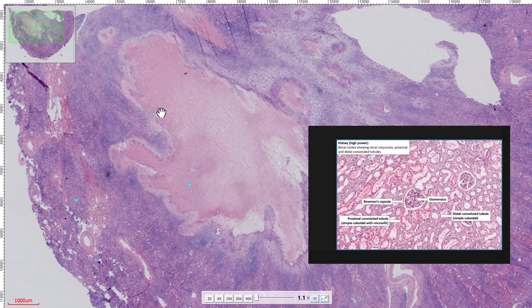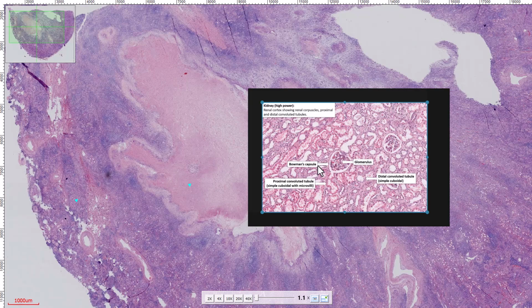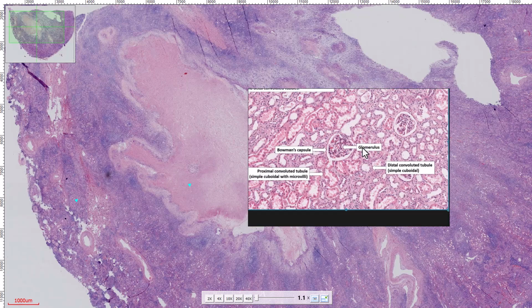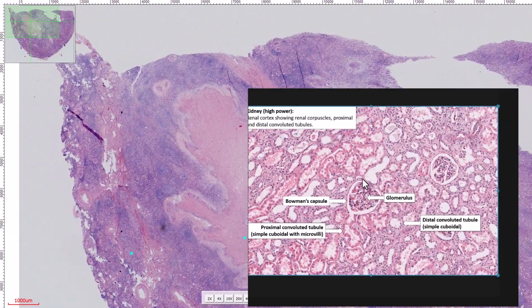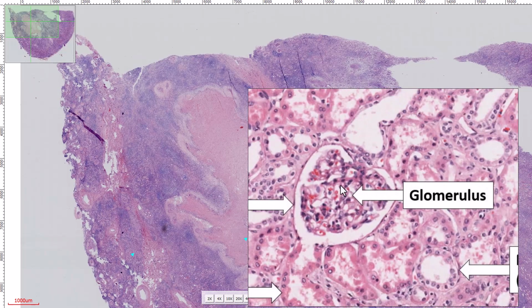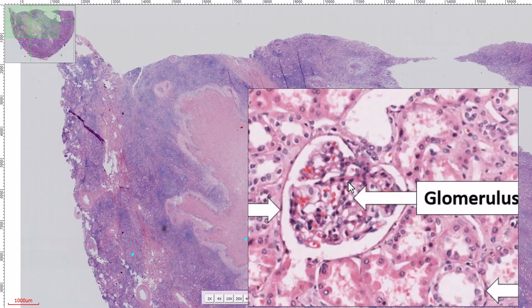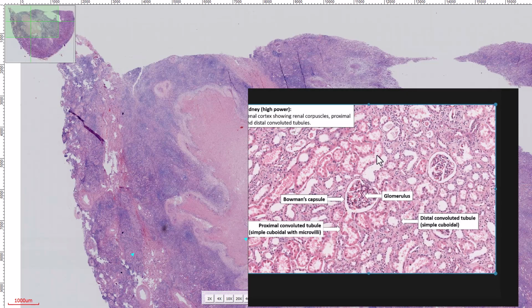This is actually the specimen of kidney. Before magnifying and looking into this specimen, I want you guys to really be familiar with the normal histology of kidney. As you can see and observe here, this is the normal glomerulus, and I want you to really see and appreciate that we have a lot of nuclei here, because I know this is our first pathologic lab class and you may not be familiar with the normal histology of kidney.